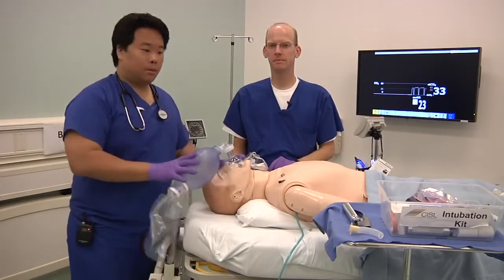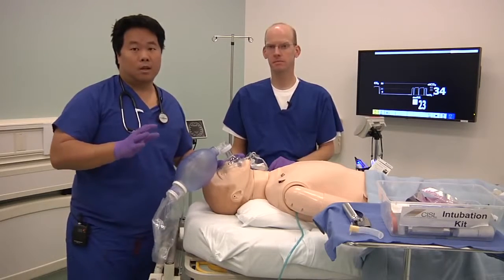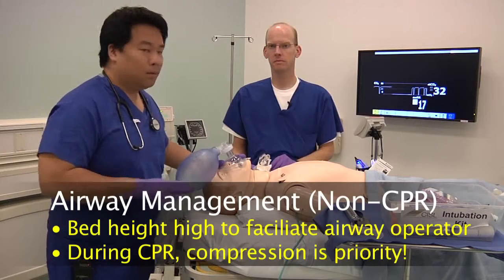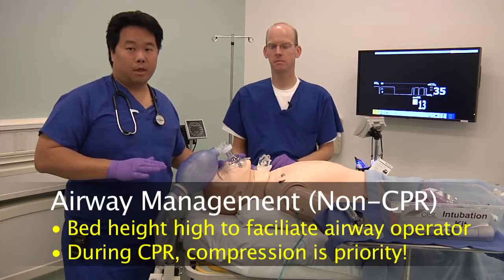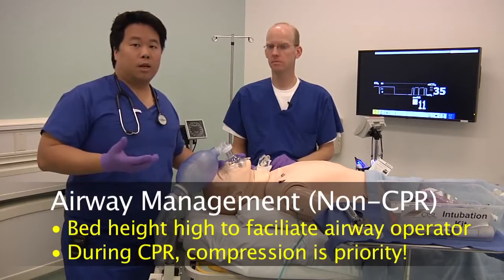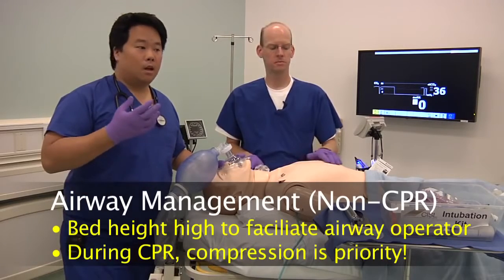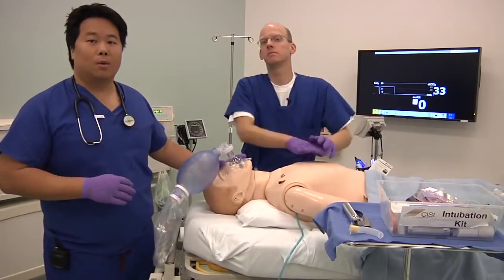So let's talk a little bit about airway management in a non-arrest setting. Now this is very different. The first thing you're going to notice is that the bed is up high. It's almost here at my belly button level. This is because the bed height at this level really helps facilitate endotracheal intubation for the operator. Obviously, if you're in a code situation, compression takes the priority, and the bed has to be much lower in order to facilitate the compressor performing chest compressions. As you can see Kyle demonstrating here, that's really not possible when the bed is this high.